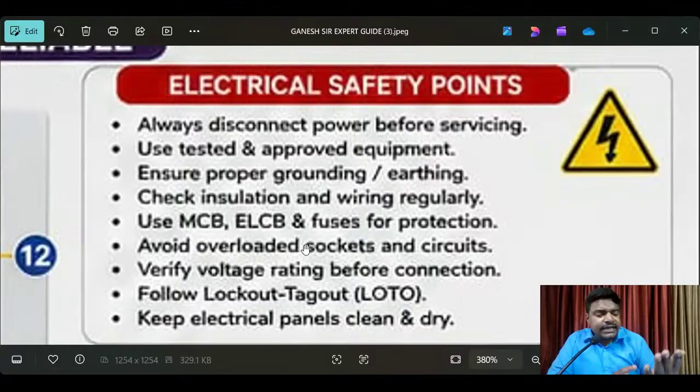So at that time you have to check properly before replacing the fuses or MCB. If you find them defective, then you have to check the main power supply. Take the multimeter and set the proper parameters. What is the requirement? AC. 230 or 240 volts is the minimum requirement for every medical equipment. Check whether that much voltage is coming, phase to neutral, using the multimeter. Check whether phase neutral earthing is below 5 or not.